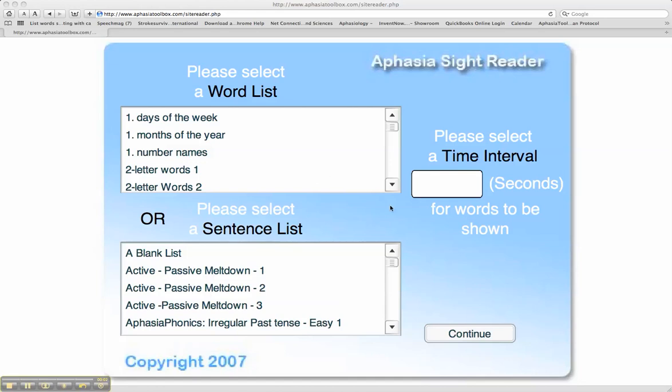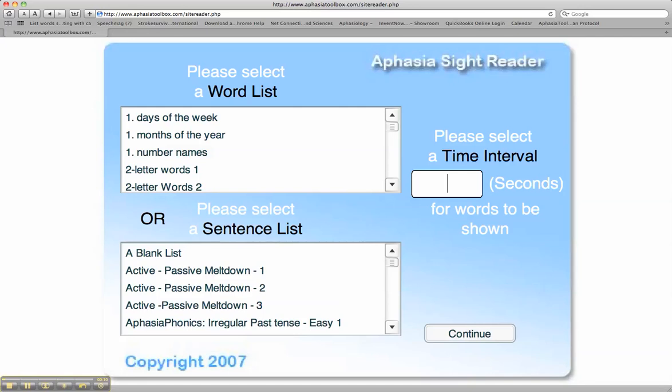When using the Aphasia Sight Reader to work on spelling and simple word recognition, in the time interval box, please select the amount of time that the stimulus will be exposed to the client. Typically, this would be three to four seconds, perhaps five or six.